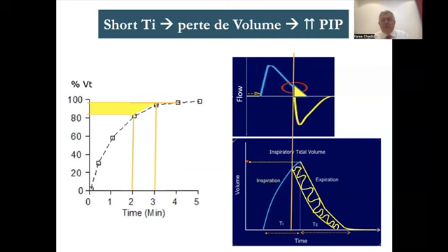So this volume lost will be replaced by PIP. Since we lost volume, the PIP will shoot up to compensate for that volume. So you would come and think that the patient is not ready for extubation or he's needing too much pressure, while in fact, all he needs is enough I time. So don't allow the I time to be shorter than permitted.